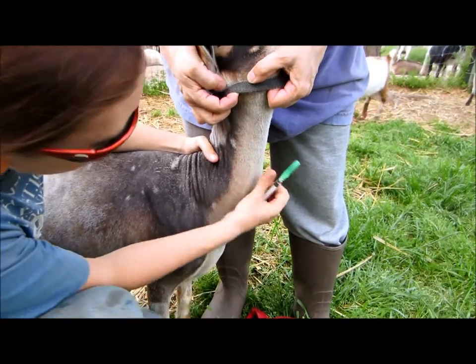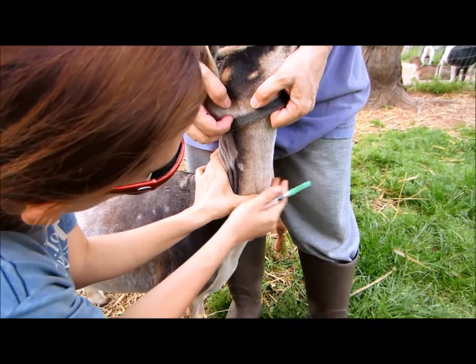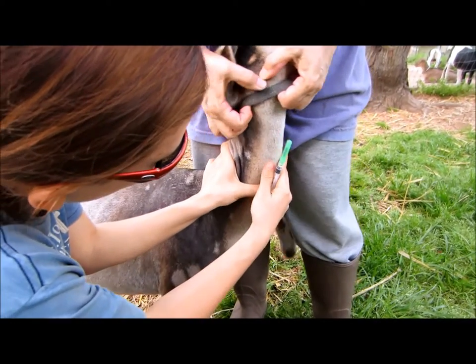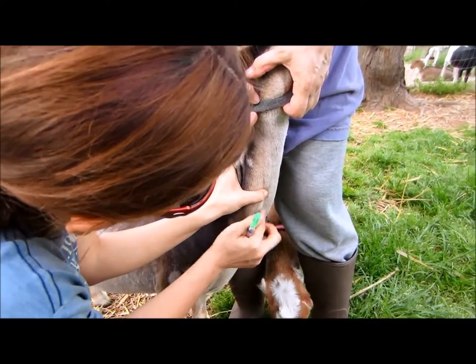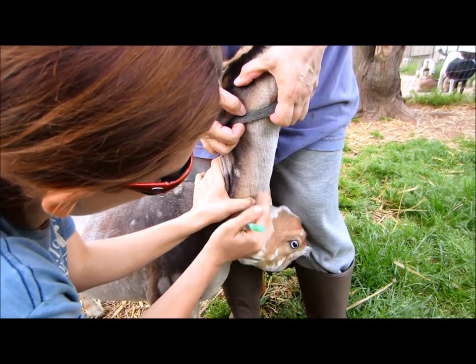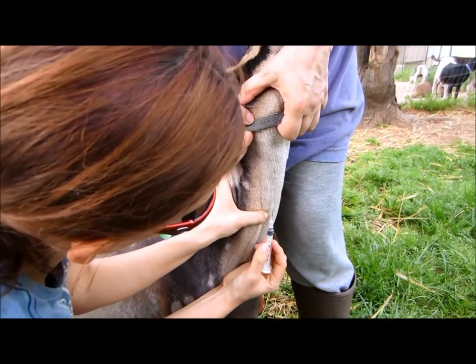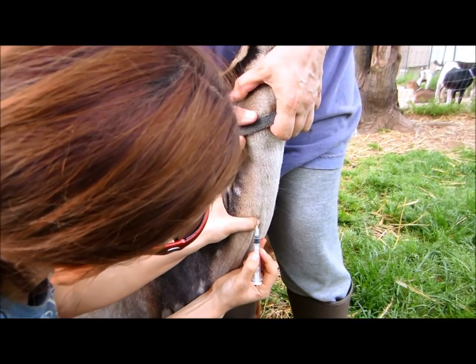This is Miss Witt's Crack and she's going to be our poor little pokey. You just hold the head up like this and then you can usually press down the side of the neck. The jugular vein pops right out — you'll see it start to get bigger and bigger. You always want to enter at an angle; don't poke straight through.